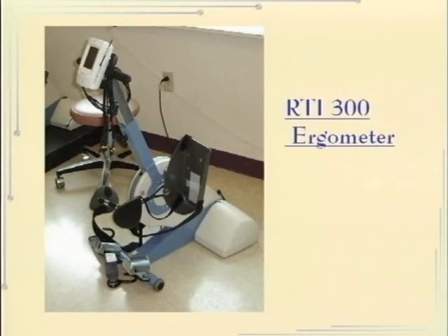And the machine has a little output out here that will track how much effort is being required to push the pedals forward. The idea is to gradually decrease the amount of strength that the bicycle is putting into making one cycle and then transfer that over to the individual who's actually activating the bike. If the rotations fall below a certain number of cycles per second, then the bike starts to do more work. If you're going faster, the ergometer senses that, and then it cuts back on the amount of work it's doing so that you're doing more of the work. So it requires some fine-tuning. It requires that the therapist gets a good sense of what you're capable of doing, and then it can be set up to be an exercise device for an individual patient, depending on what their needs are.